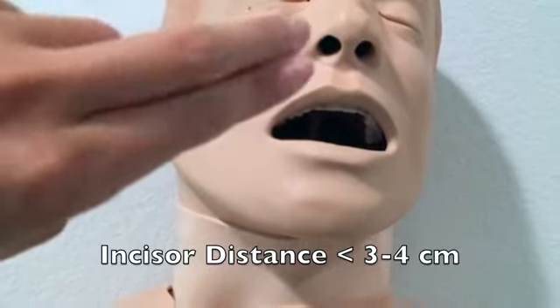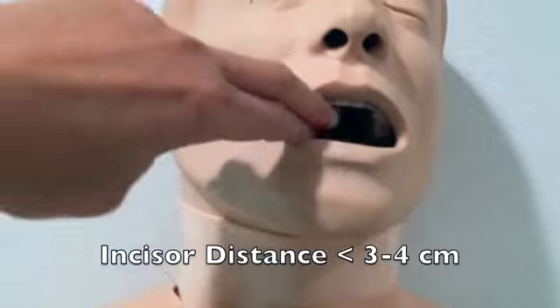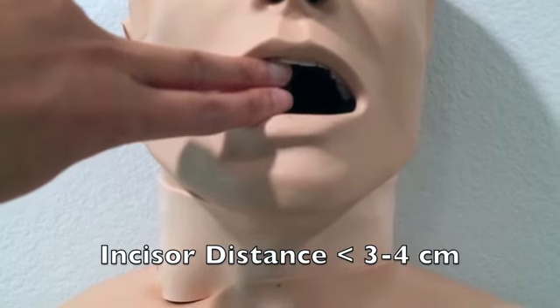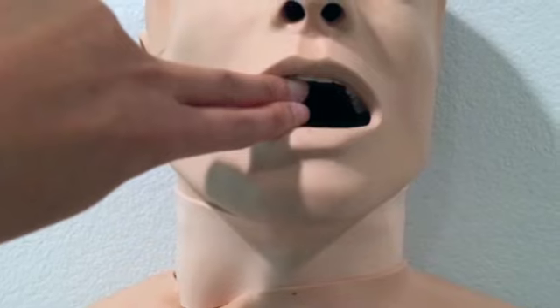I don't recommend putting your fingers in the mouth, but you can assess it next to it. But this is a mannequin, so I'm just going to put it in. So you want about 2 finger breadths. If it's less than this, that's bad. It's about 3 to 4 centimeters, so less than 3 or 4 centimeters is bad.